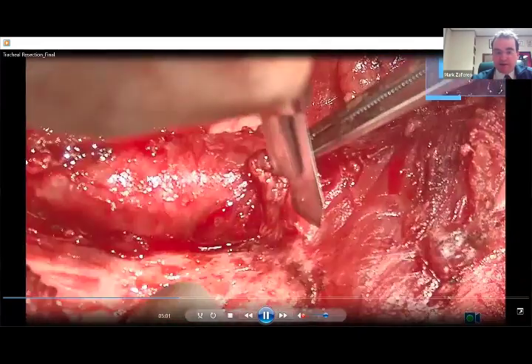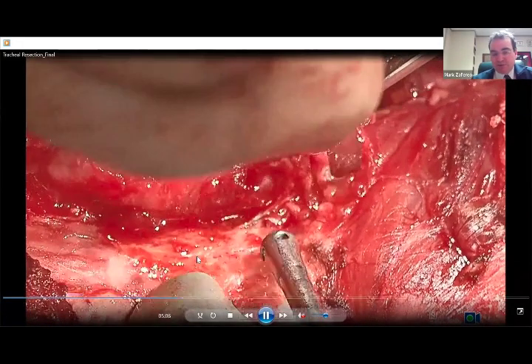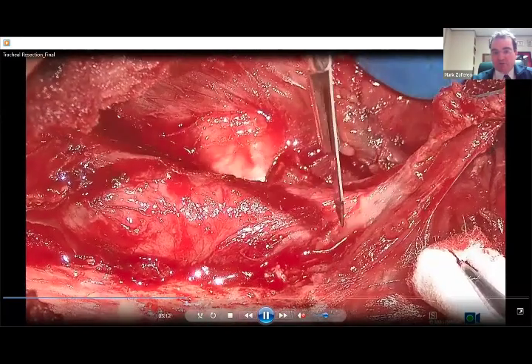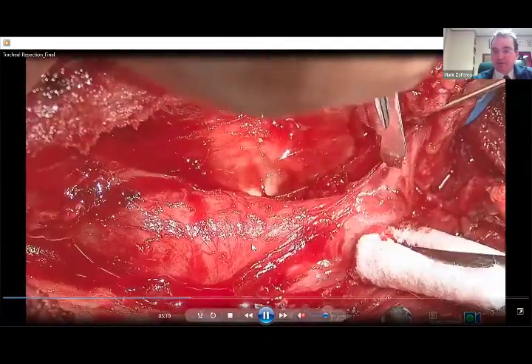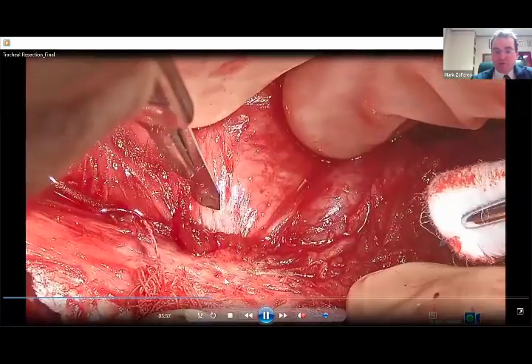I typically do a betadine lavage after a case like this, but you typically will know if you have a micro leak, because the esophagus will no longer have all this air in it. As long as you see this esophagus nice and pooched out like this, you're okay. You don't typically have a leak there. So, moving on a little bit.